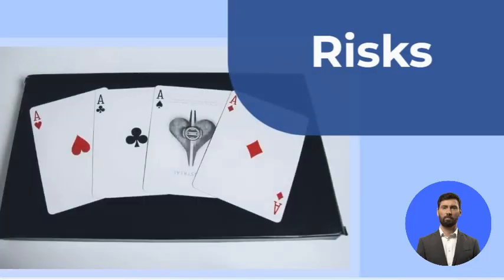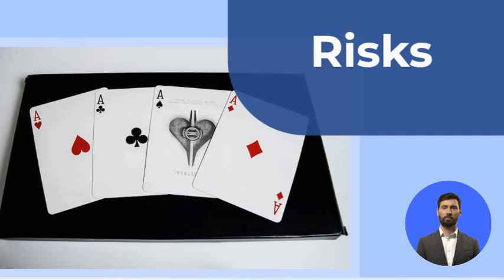Possible cardiac ablation risks include bleeding or infection at the site where the catheter was inserted, blood vessel damage, heart valve damage, new or worsening arrhythmia, slow heart rate that could require a pacemaker to correct, blood clots in the legs or lungs, venous thromboembolism, stroke or heart attack, narrowing of the veins that carry blood between the lungs and heart, pulmonary vein stenosis, damage to the kidneys from contrast used during the procedure, death in rare cases.